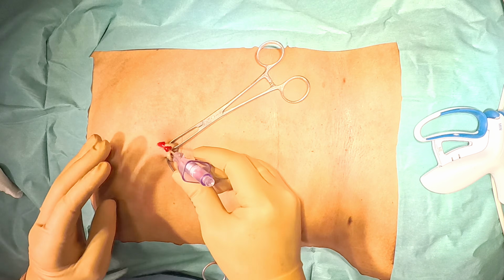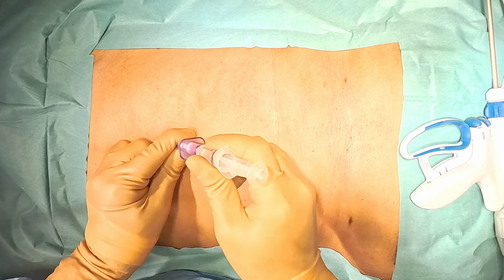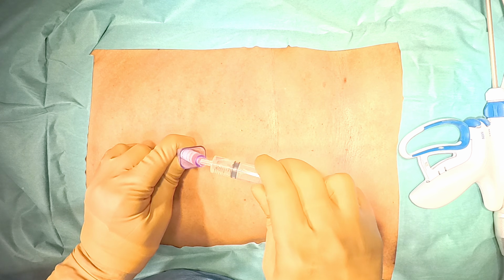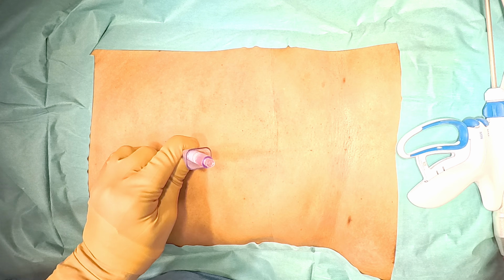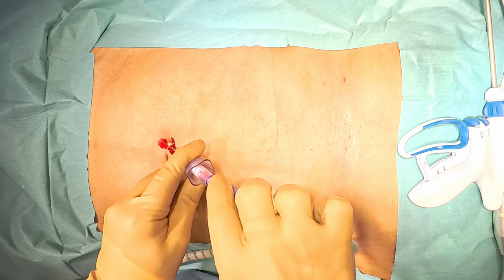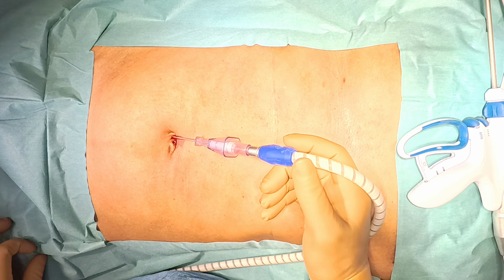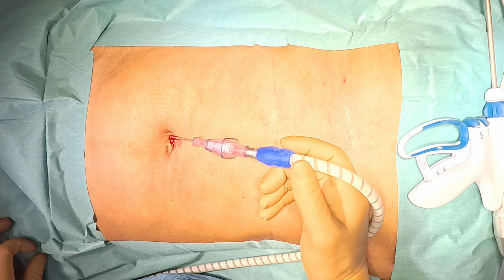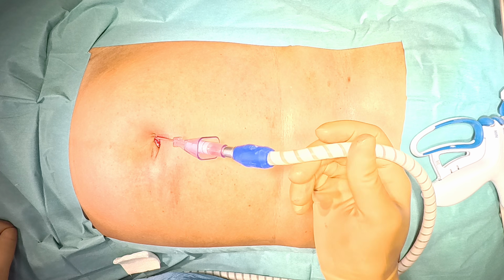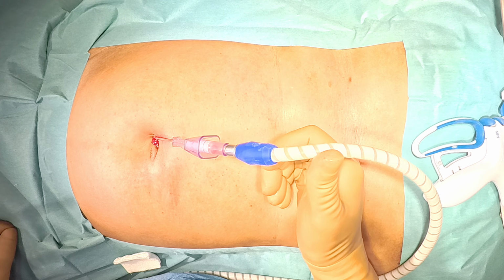and the insufflation is started with the Veress needle. So, here we are doing irrigation, suction and the hanging drop test. And then the pneumoperitoneum will start. So, we are using the preset pressure of 15, and slowly the actual pressure will reach the preset pressure, and the flow rate is 1 liter per minute. So, we can see gradual homogeneous distension and we are waiting for the pneumoperitoneum to establish.